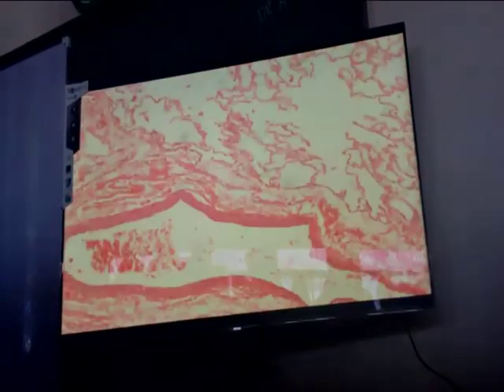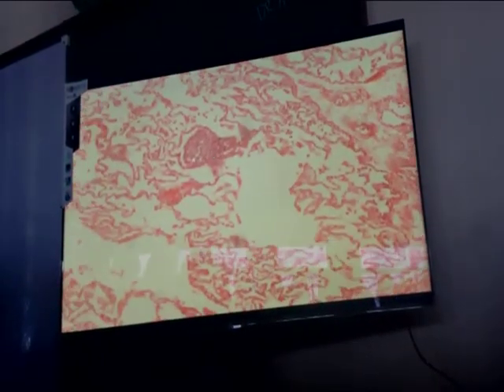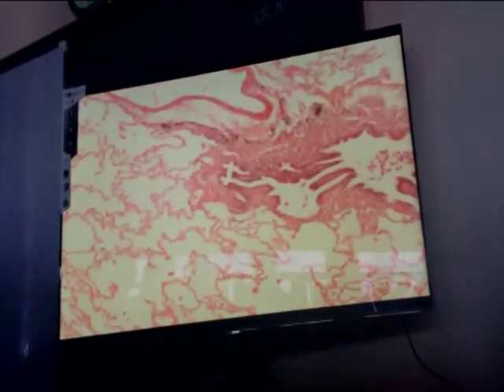You should be able to diagnose this condition already. That is the characteristic abnormality that is pathognomonic for the condition. Let us look for the characteristic. There. That is the diagnosis for this condition.